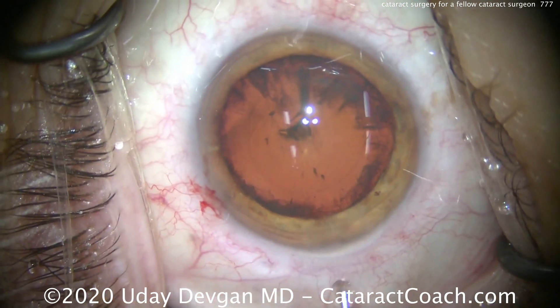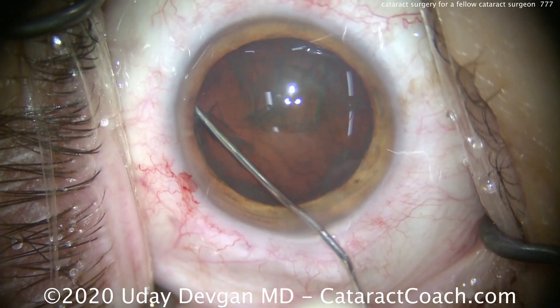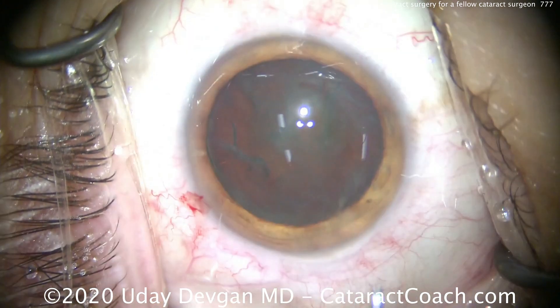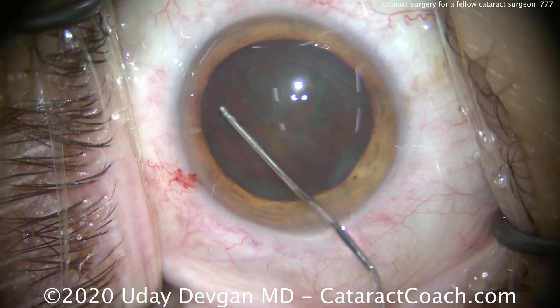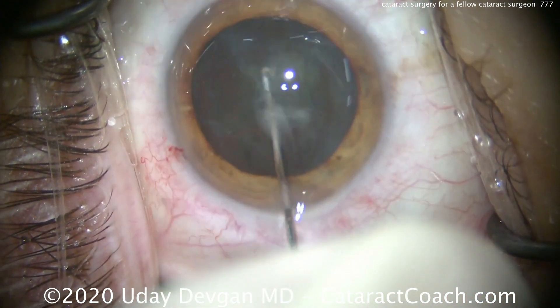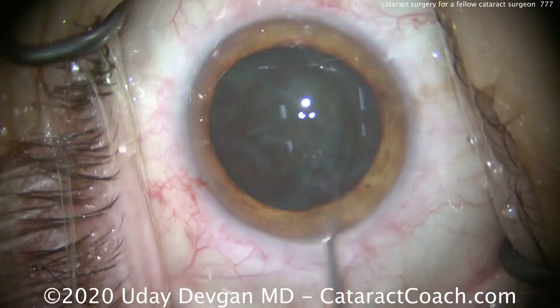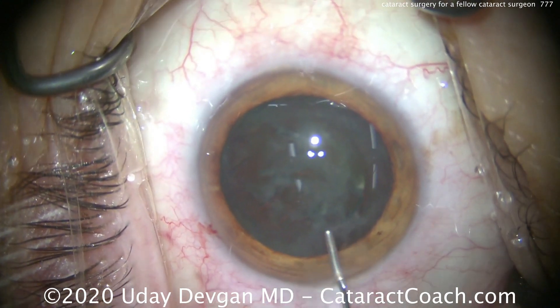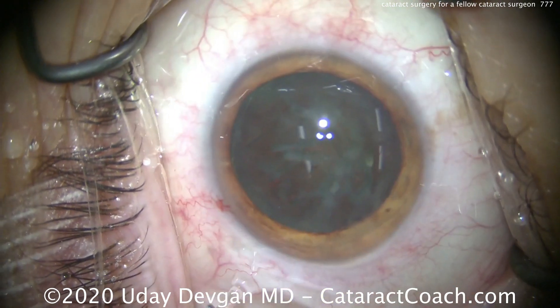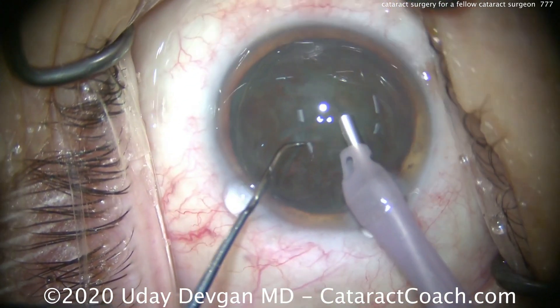Hydrodissection will be nice and gentle. This patient's cataract is not too bad — a little bit of nuclear sclerosis and mostly cortical spokes in the central visual axis. After a little hydrodissection, we'll rotate that lens nucleus and then do phaco chop. We'll hydrate in both directions, get good hydrodissection. We want to see that nucleus spin just a little bit — and there we go, very nice. Now let's recoat that central endothelium with our dispersive viscoelastic and put the phaco probe in the eye.